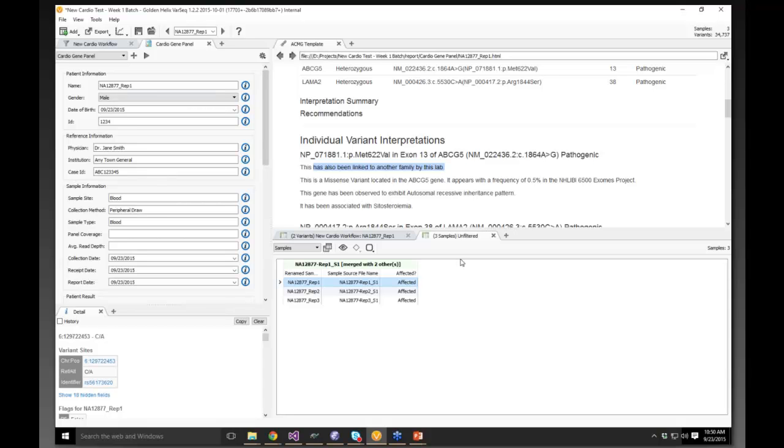If, on the import process or using VS Pipeline's automated capabilities, you added extra sample-level fields, those could be something like, in VS Pipeline, you might integrate that with a script that looks up the sample, hits a database, pulls it from a LIMS, and then adds a bunch of fields, such as these, to the project. And if they're in the project, they can be pulled into the report. So in your lab setup, you can automate and push the data through in the way necessary, especially with VS Pipeline as your engine.